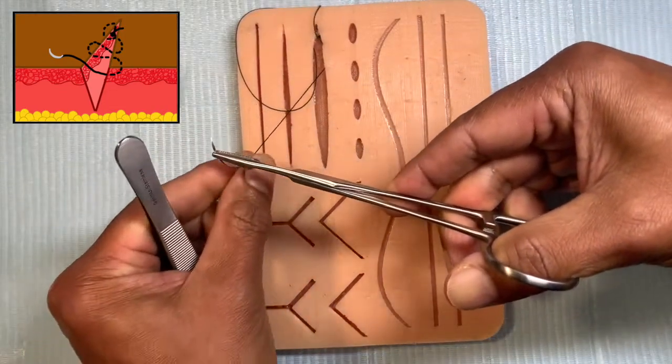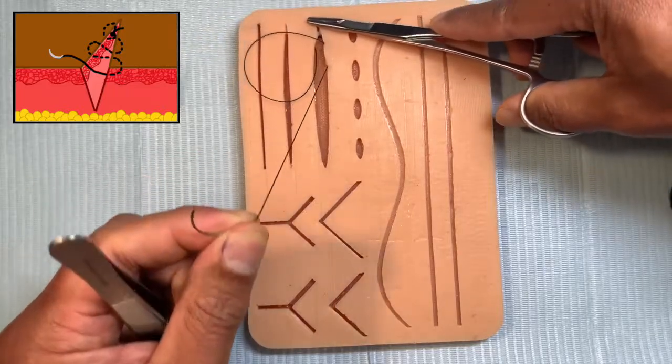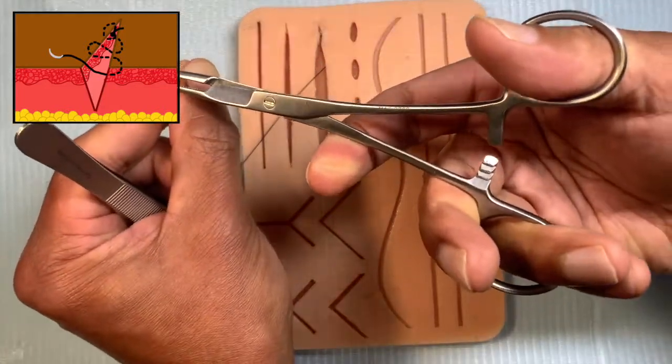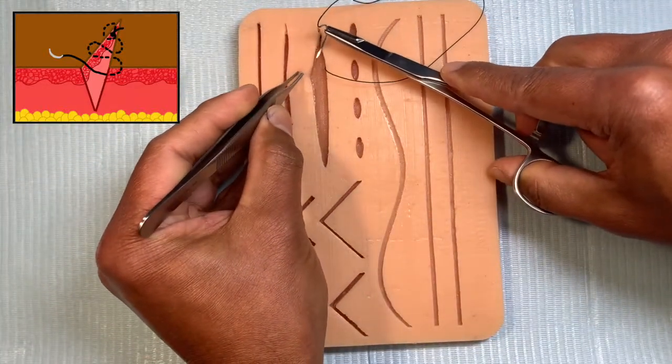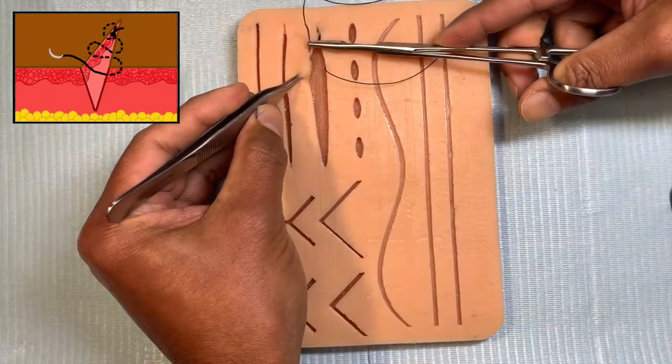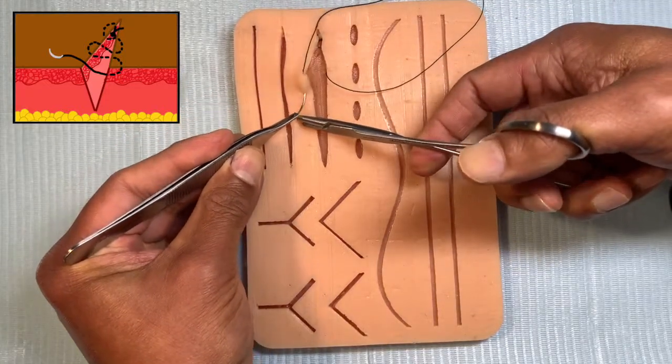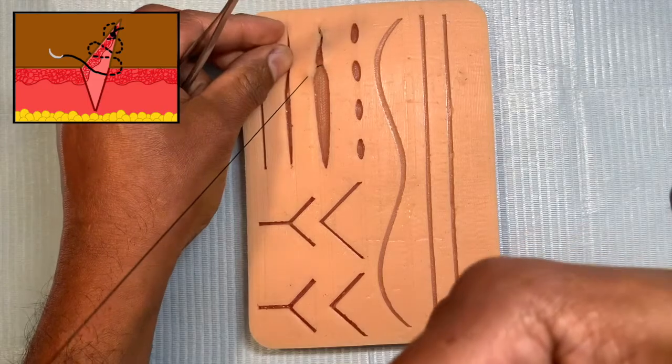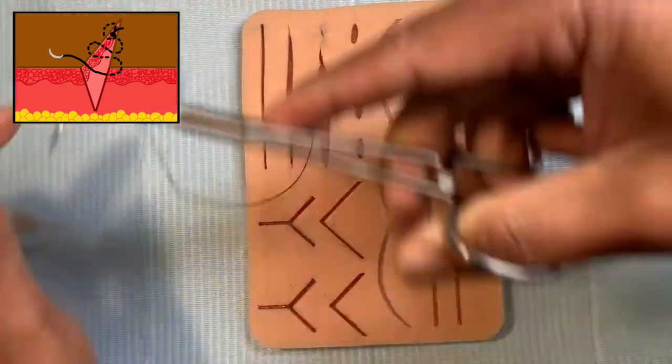Respect the needle, making sure you're not holding it from the tip. This is all going to start coming together. This is a very good suture because you're avoiding doing any stitches on the skin, so it reduces suture removal anxiety for the patient. Carry on like this till the wound is completely closed.